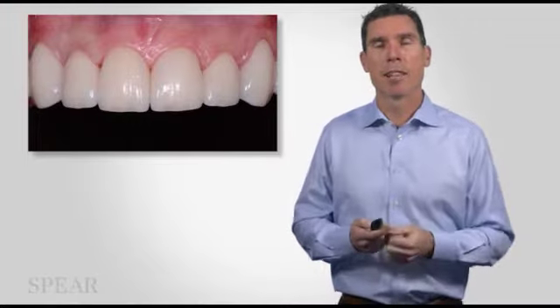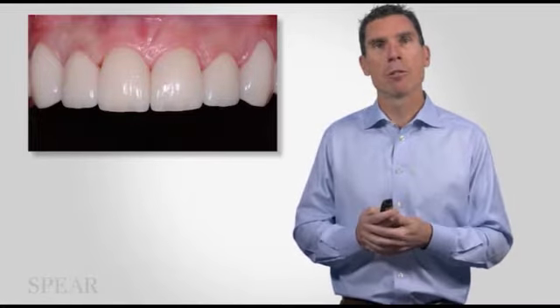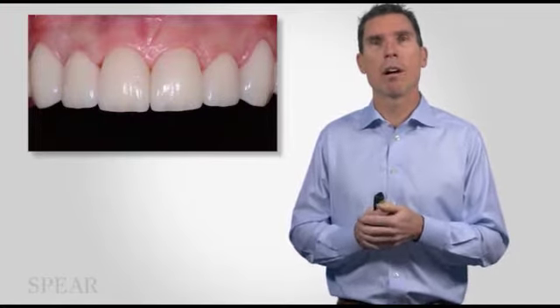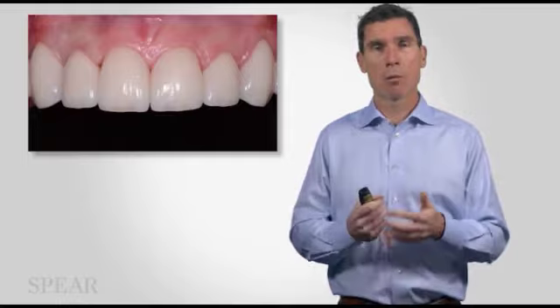What's interesting, though, and I thought I'd bring this to your attention, is as I put those permanent restorations in on the top, and they're crowns now, right? It was interesting. Those top teeth, the front teeth, were hitting harder than the back teeth. And I was like, crud, I've made a lot of adjustments and things have changed, but I really trust it because that was what I planned. And so as opposed to reducing the lower composites, because we put those where we wanted them in our head, and as opposed to grinding off the lingual of those upper crowns, because they were really what we decided we wanted based on something, I had lost just a smidge of that vertical.